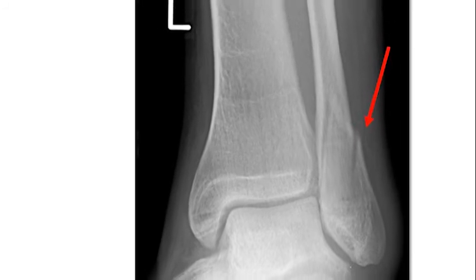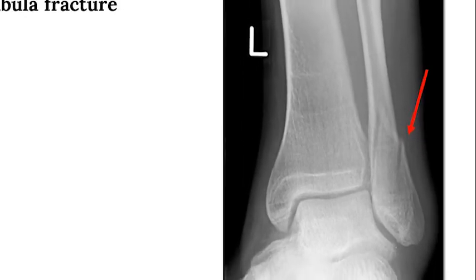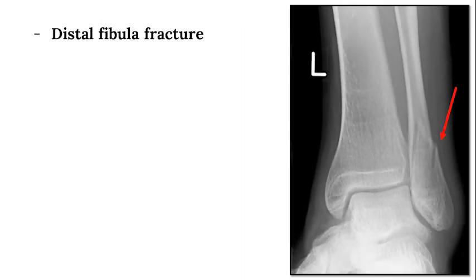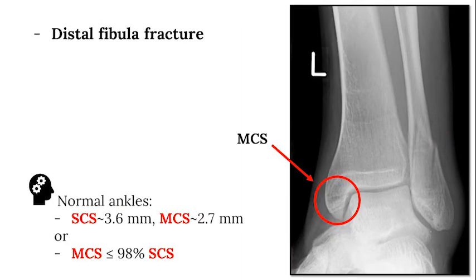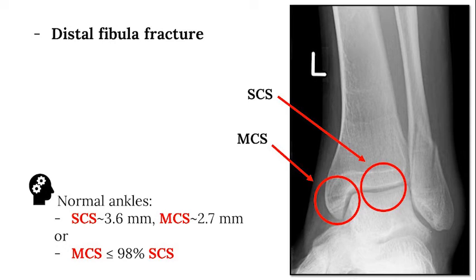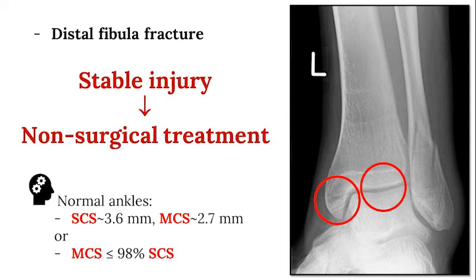In this example, there is a fracture of the distal fibula. However, the medial clear space appears normal — less than the superior clear space — so no medial injury is present. Therefore, despite the fracture to the fibula, this is a stable injury that can be treated without surgery.